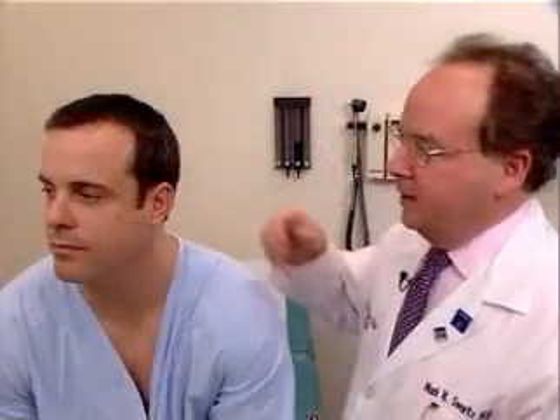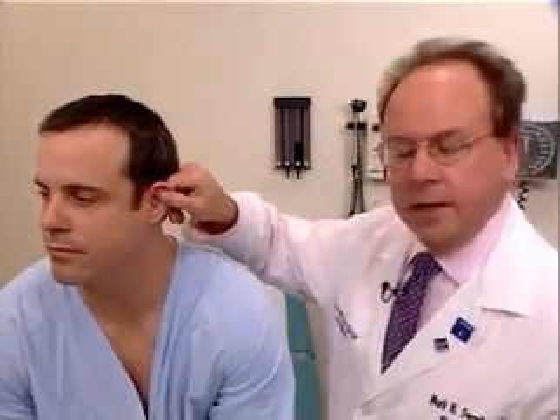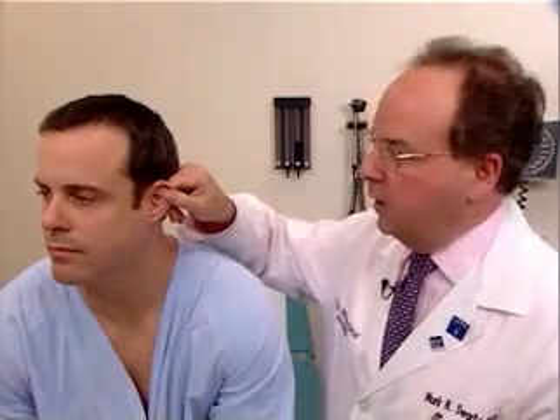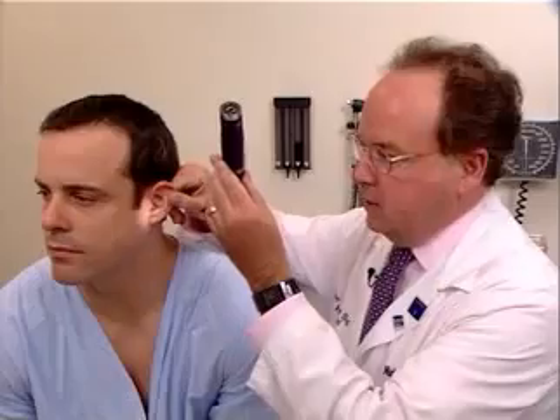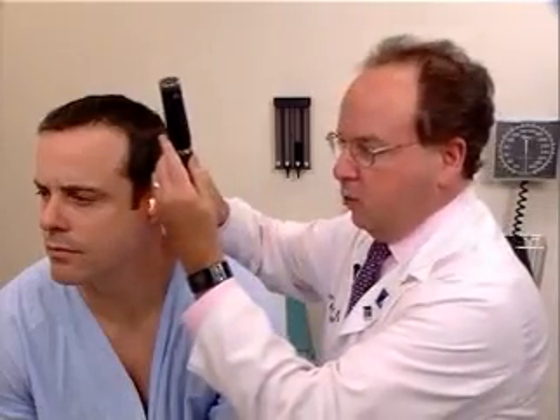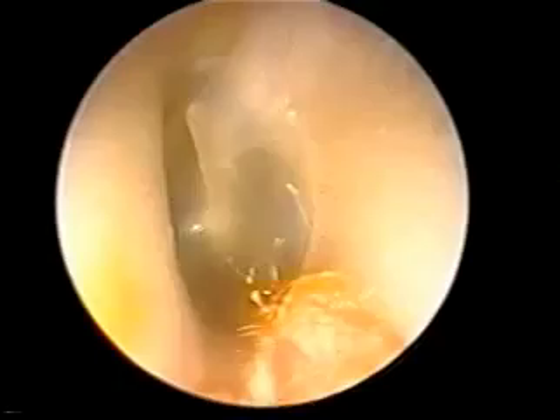To examine the left ear, the examiner uses his or her right hand to pull on the tragus and earlobe, up, out, and back. And the otoscope can be entered into the external canal, either as was demonstrated on the other ear, or held in this manner. And the speculum is inserted, as I'm demonstrating now.